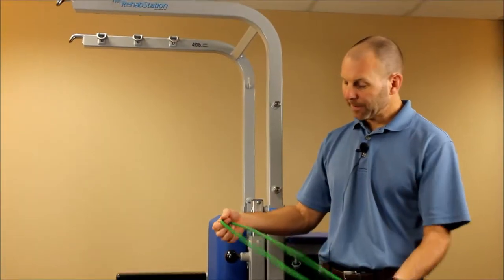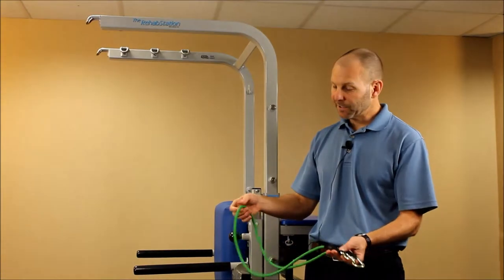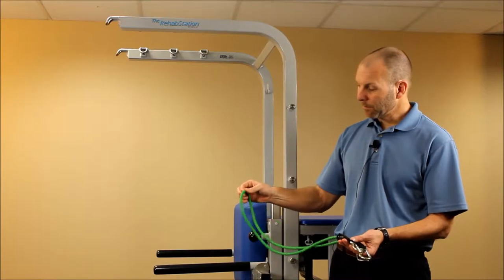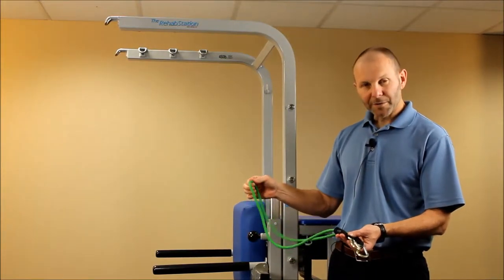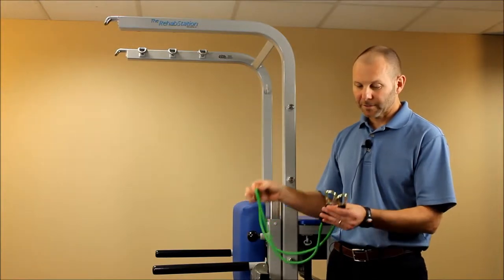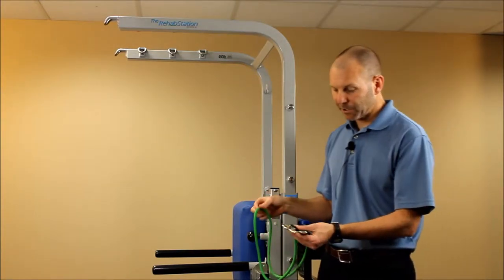An important feature of these resistance tubes is they have a limiter inside — a piece of fiber rope — that prevents over-stretching, and also if the tube were to break, it would not come back and strike the patient. So it's important to utilize these elastic cords with the rehab station.